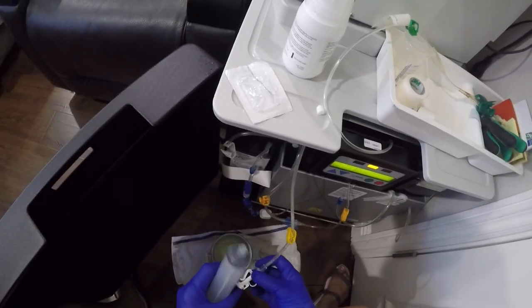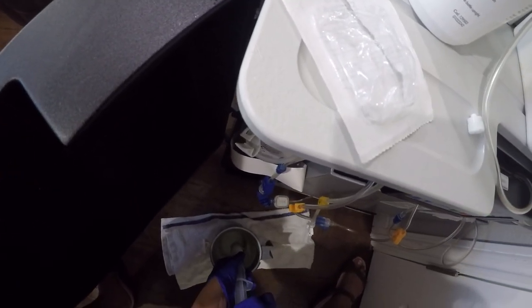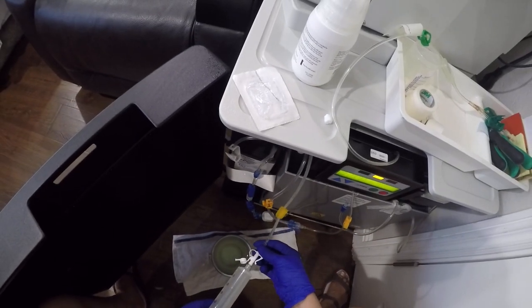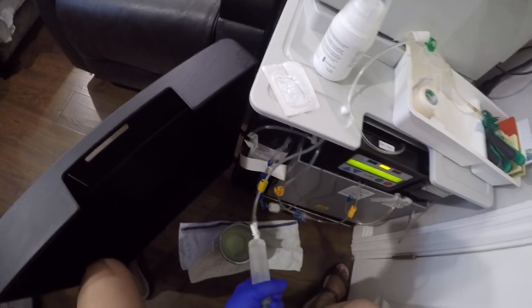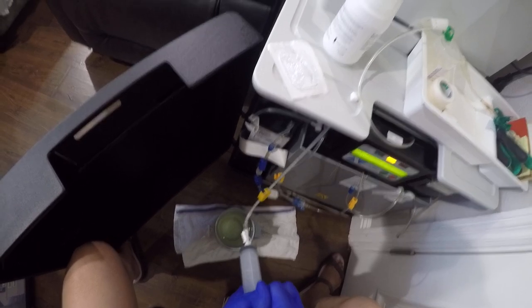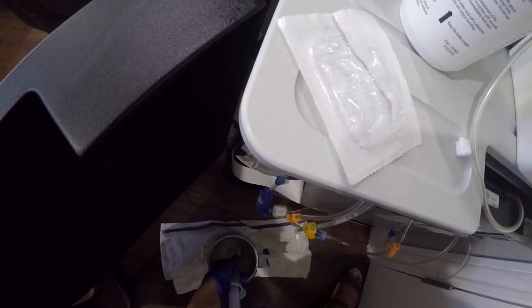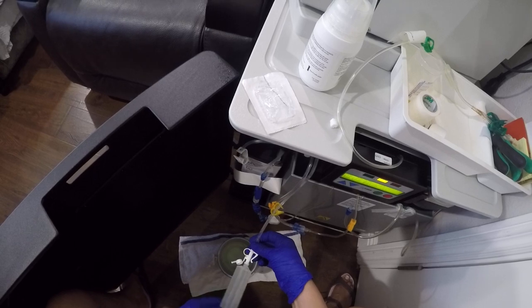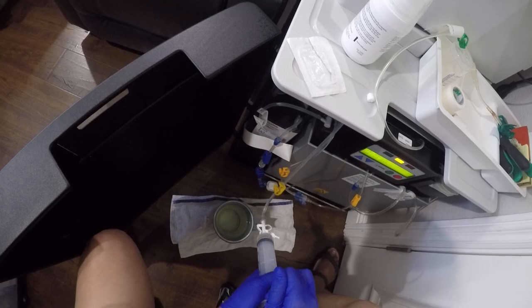Again, open and attach, fill it up first. You do this about six times.